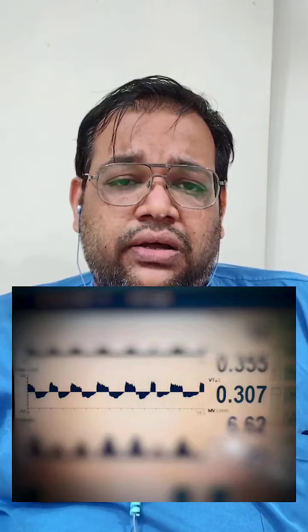And generally our practice is don't attempt weaning more than once in a day. So if the patient fails the morning session of weaning, then probably give rest to the patient for the whole day and attempt weaning again the next day. So we were thinking whether to attempt weaning the next day, but at that time we noticed this peculiar waveform in the flow scalar, and this waveform is actually the presence of water in the circuit.